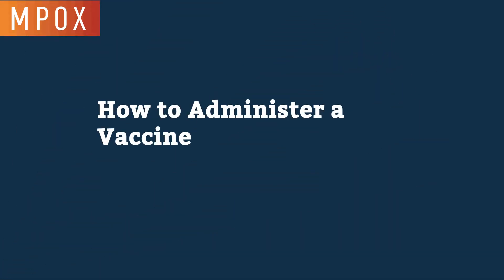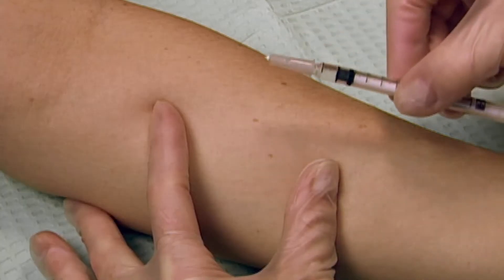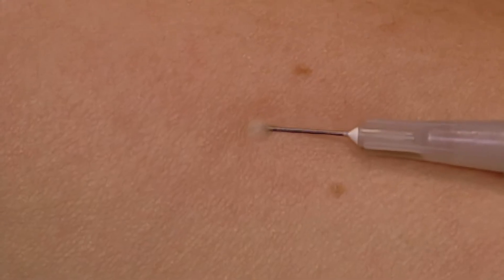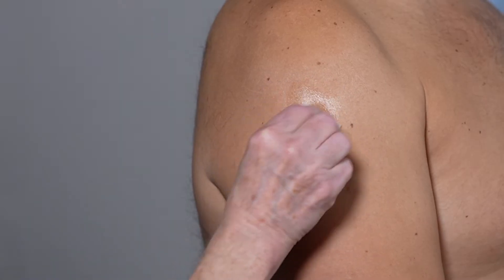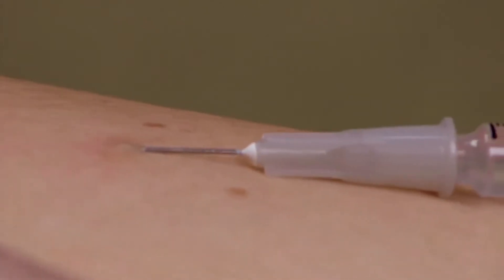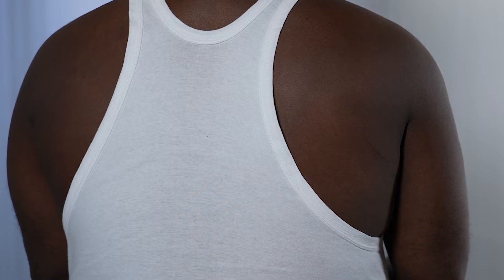This video explains how to administer a vaccine intradermally, or into a shallow skin layer, in different places on the body. Intradermal administration of a vaccine is usually done in the forearm. If the patient is concerned about having a mark on their forearm, the upper back below the shoulder blade or the skin over the upper arm in the deltoid area can be used. We will first demonstrate administration at the forearm site and then review administration in other places on the body.